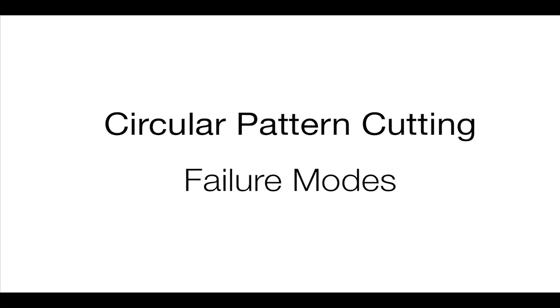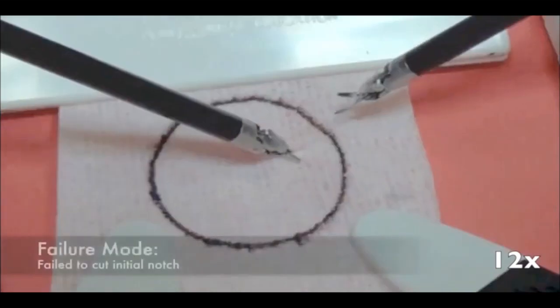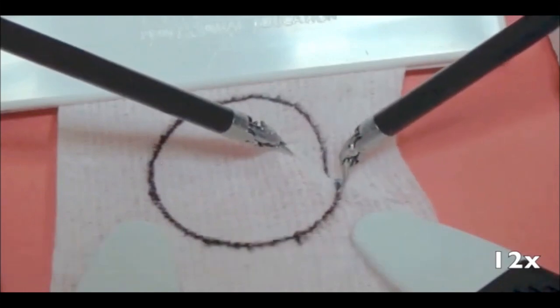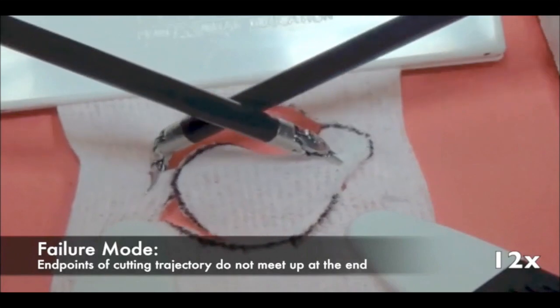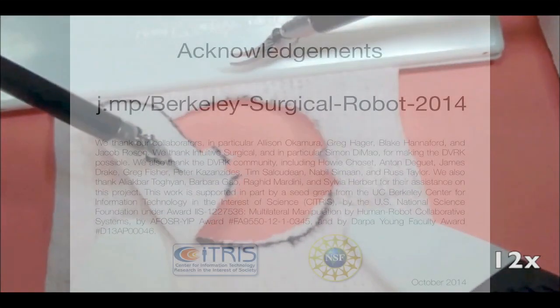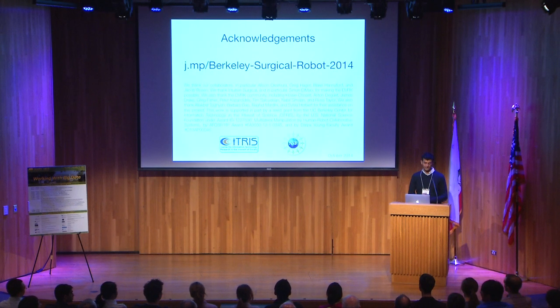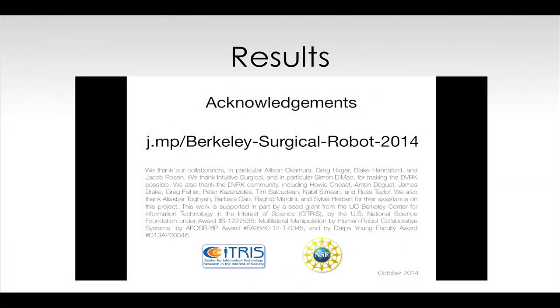However, not all trials were successful. We show here failure modes of this subtask. We are working to improve robustness for future work. So as you see, the method, of course, does not perform perfectly well. And as part of my future work, I'm working on automatically generating these finite state machines so that you can generalize for a larger set of tasks.